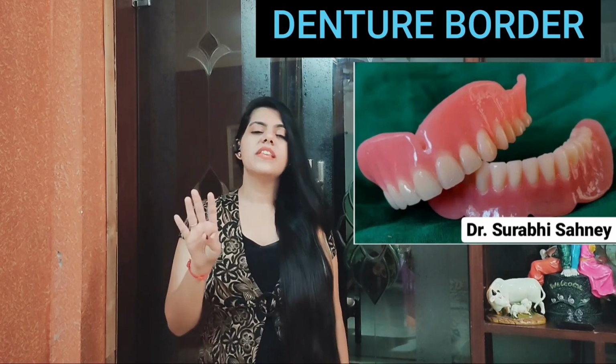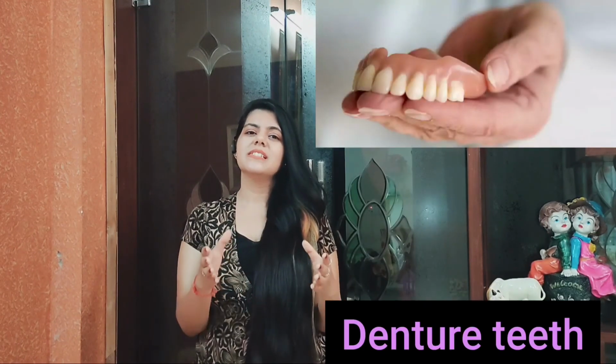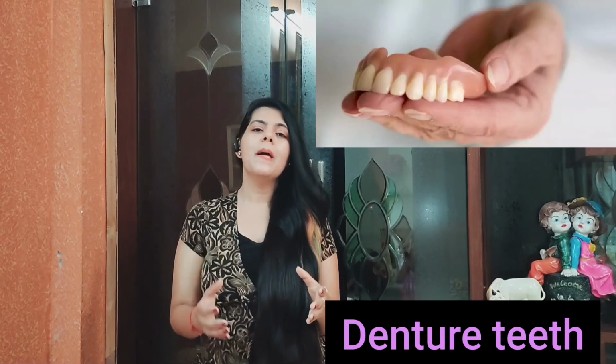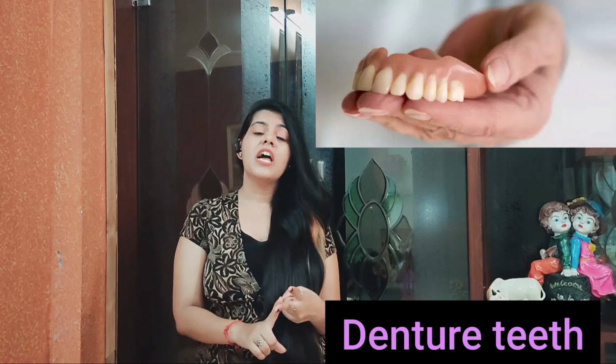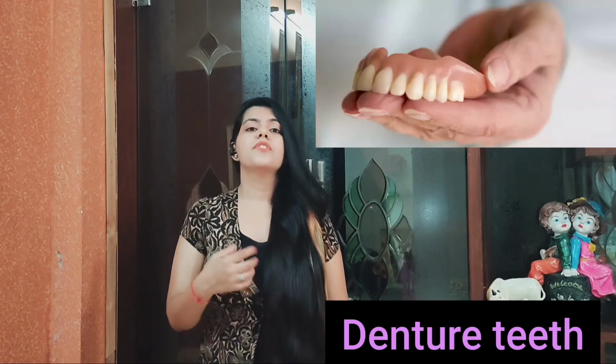Begin with the fourth and the last important topic of the complete denture, that is the denture teeth. I think this is the most important part or the component of the complete denture, because it helps in the mastication, in the speech, and will provide the aesthetic to the person. It is of different types.